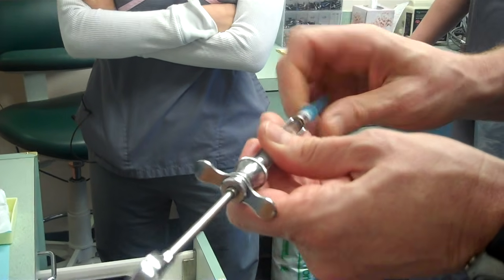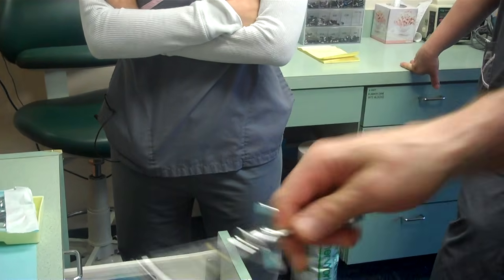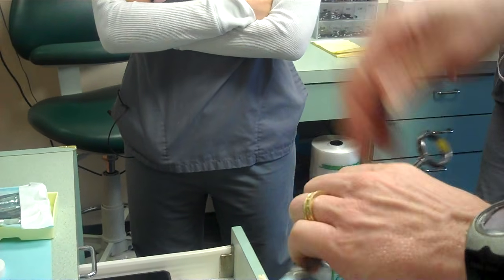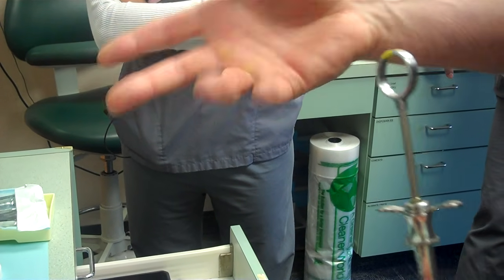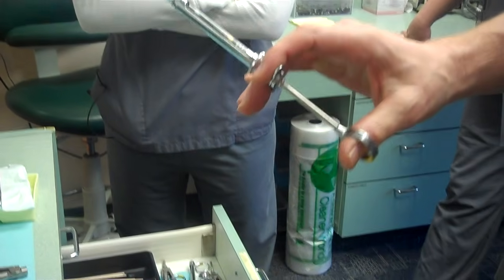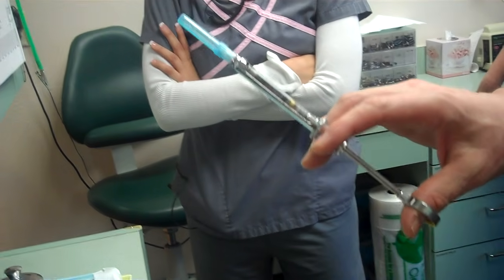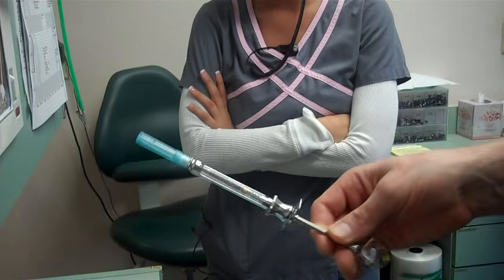Whenever you load this, load it just like that. Now if you've loaded it, make sure that the hub is set. Don't do that. Go ahead and set it, because the worst thing that can possibly happen is we do an injection and pull back and it's loose, and then I have to make a decision either to inject possibly in a blood vessel or to pull out and give them another shot. So you'll find that this is the most common setup.